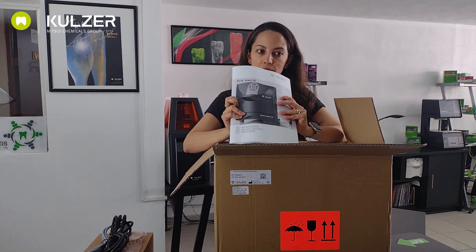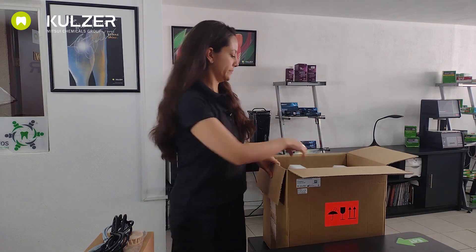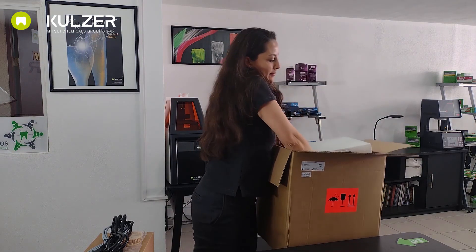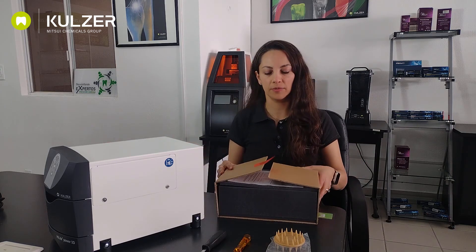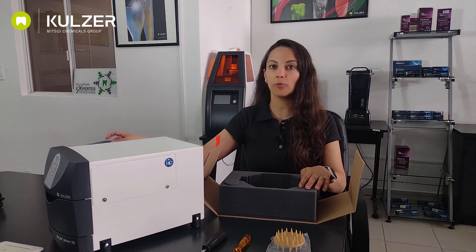The instructions are very important. They should always be followed — I encourage you and advise you to read them. Let's take the equipment out of the box. First we remove the foam and here's the device. Inside this box we have another box, so this is very protective. We also have the instructions on how to install the bowl. We also have more foam to protect it and we have a few things here.